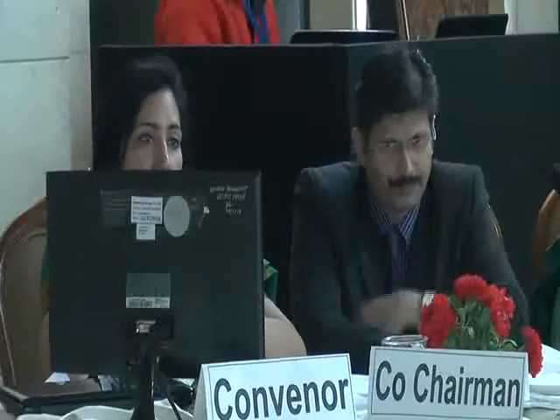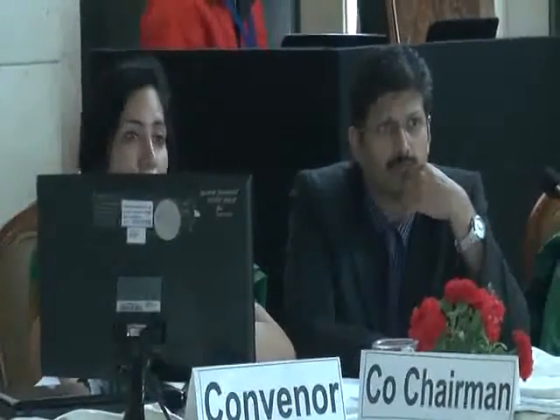Do you really find a need for endolaser? Just to complete the talk, we do tend to use endolaser many times when there are chronic tractional retinal detachments. These patients have a schitic retina, and the posterior edge may still have some fluid and schitic change. That is a candidate where we can consider doing endolaser to the posterior edge.